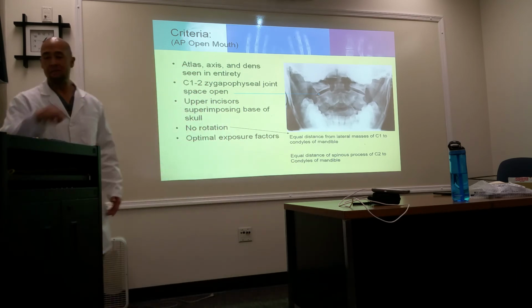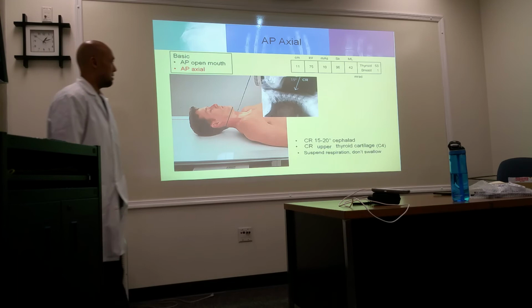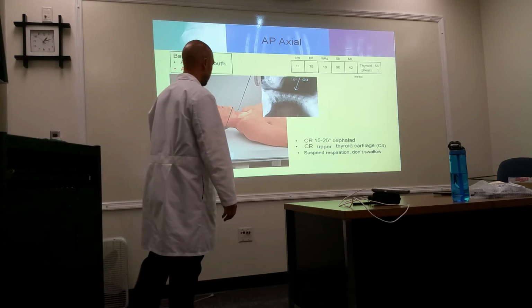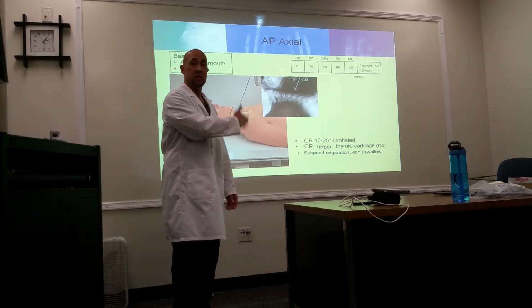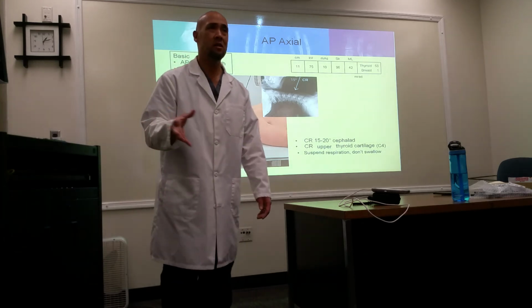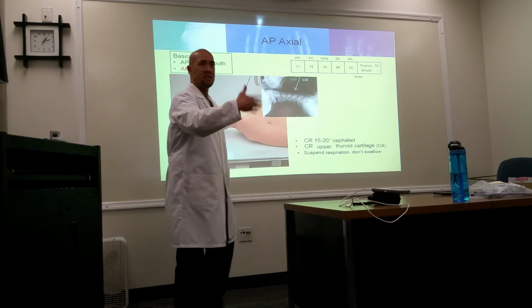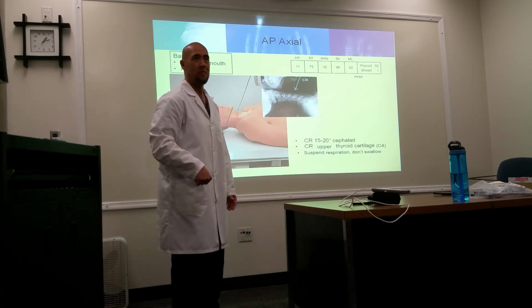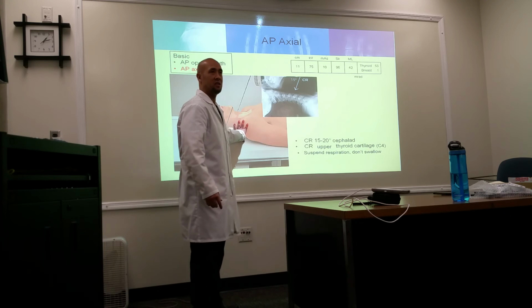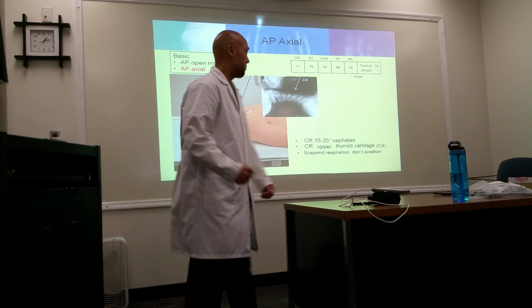So this is part of the AP study. Okay? And so here's your AP axial. Again, usually done at 40 inches. I think your book is going to tell you 40 inches. But due to practicality, you're going to have the tech doing everything at 60 to 72 inches. Okay? Test purpose, what's the distance? 40 inches. Okay? So we're going to do 40 inches.